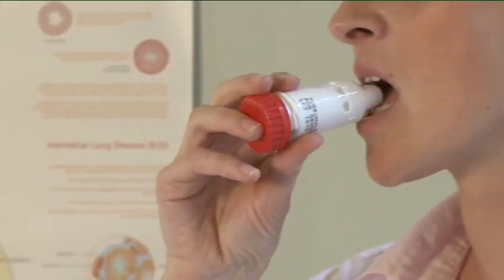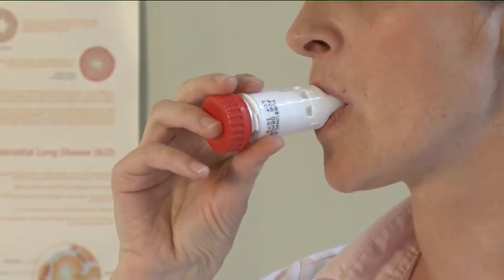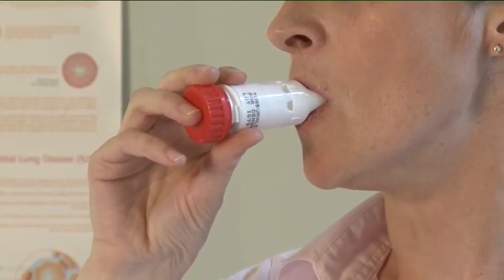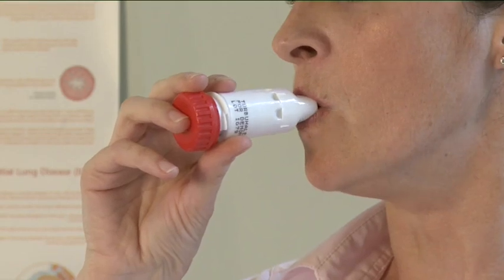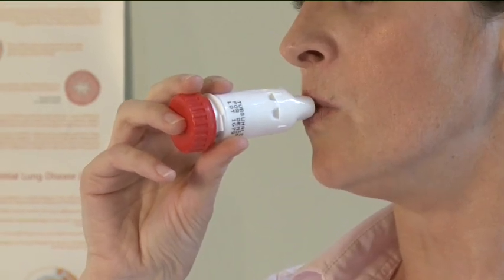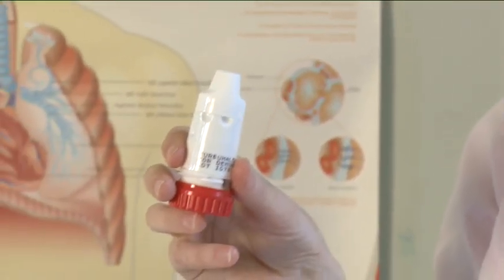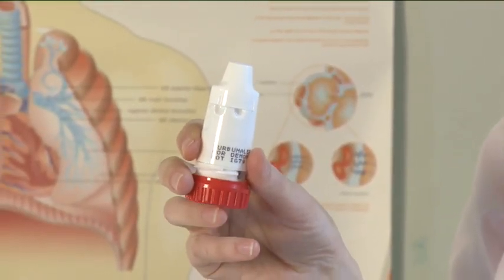Place the mouthpiece gently between your teeth and close your lips. Breathe in as deeply and as hard as you can through your mouth. Hold your breath for 10 seconds or for as long as it is comfortable. At the same time, remove the mouthpiece from your mouth. Do not chew or bite on the mouthpiece. Then breathe out gently.